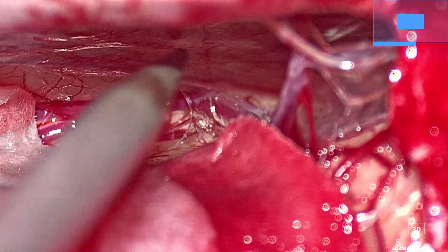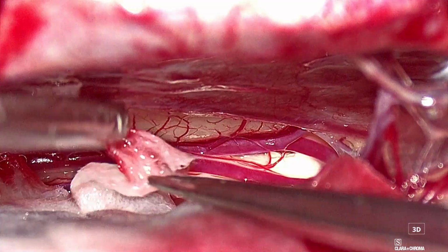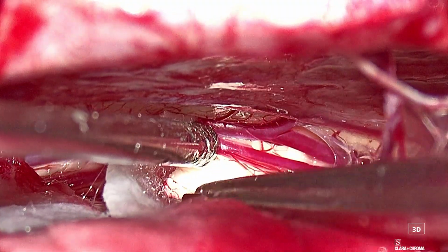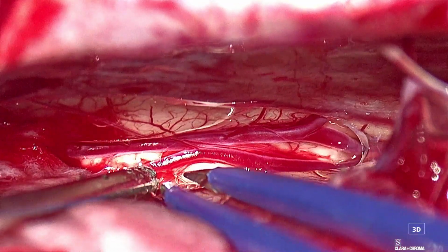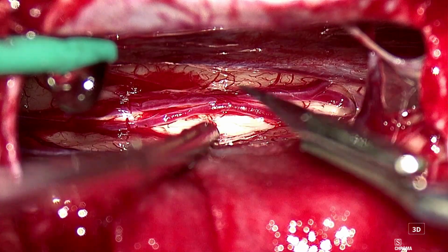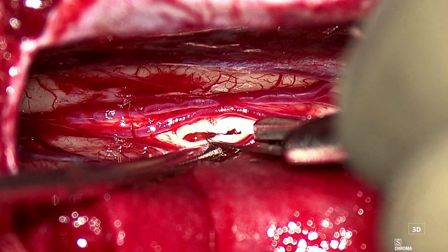At this stage, navigation was used to identify the exact location of the tumor so as to plan the site of the callosotomy. Both the vessels were safeguarded and mobilized to the opposite side. Callosotomy was done and deepened at the pre-marked location.